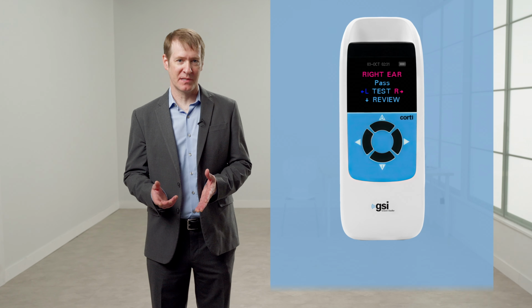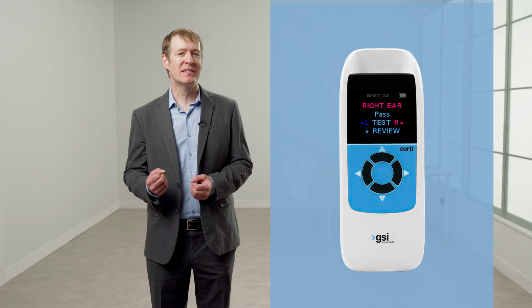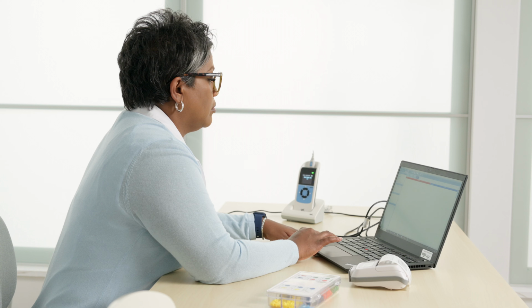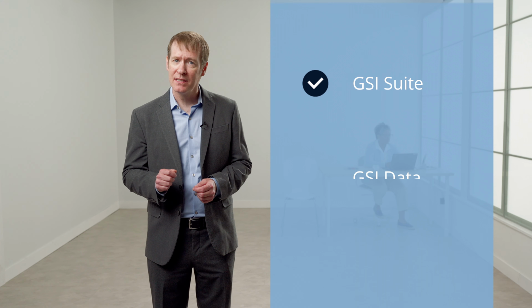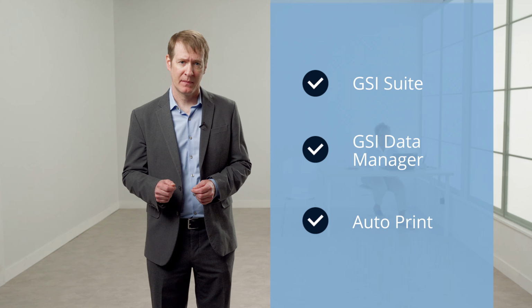When the test is completed, it is possible to view the results by pressing the down button on the Corti. Only the most recent right and left tests are available for viewing. The Corti is compatible with 3 software solutions from GSI: GSI Suite, GSI Data Manager, and GSI AutoPrint.